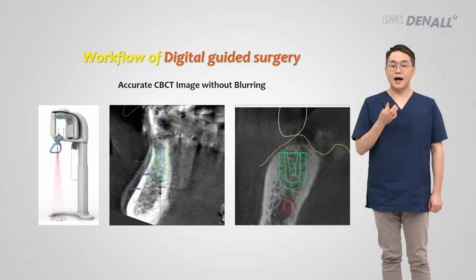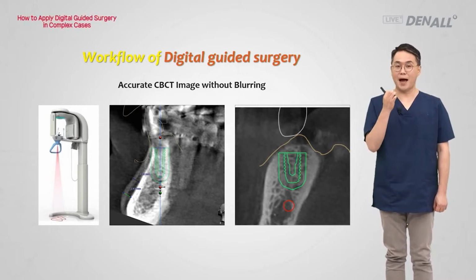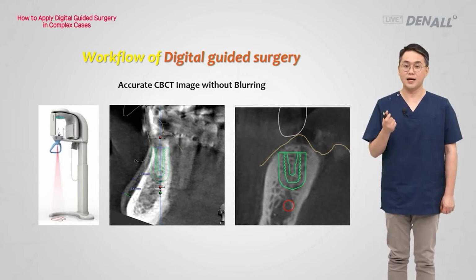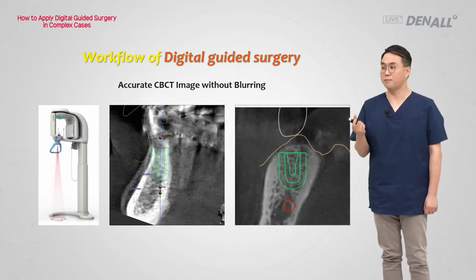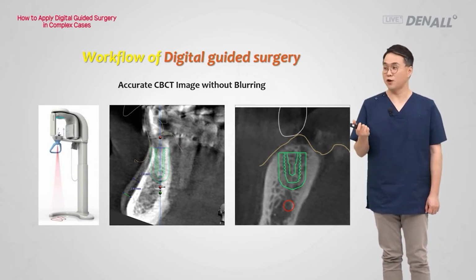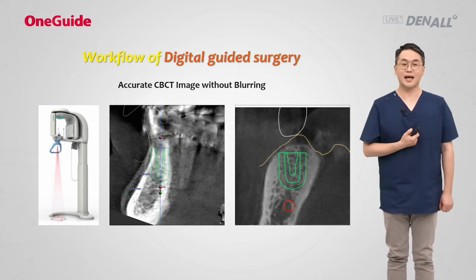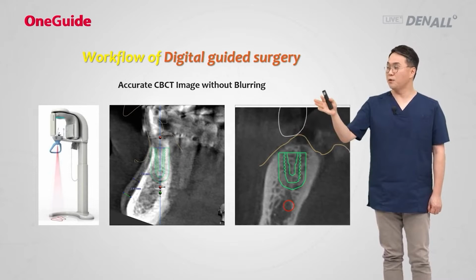If there are teeth in upper and lower jaws, a patient can bite down on a bite plate and control the lower jaw movement. But in the case of a complete edentulous patient, or severe mobility in the remaining teeth in the upper or lower jaws, or the patient has Parkinson's disease, they cannot control the movement of the lower jaw, so a blurring problem would occur. In that case, the merging would not be very good.